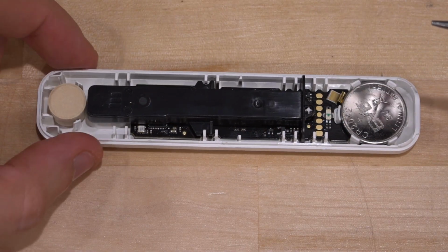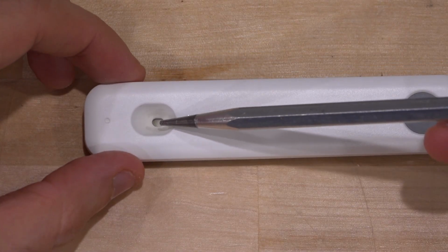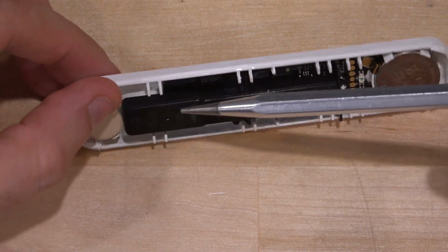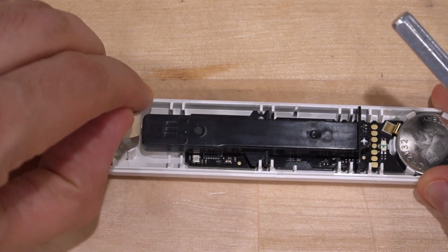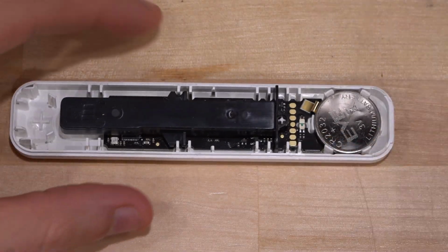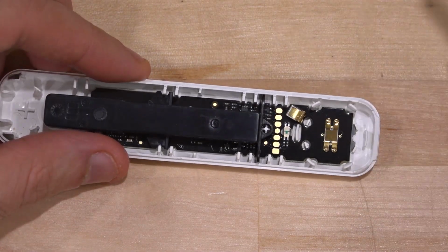And let's see what we have here now. All right, pretty cool. So on this side is where you drop in the sample and of course the activation and as well as your own sample mixed in with it. I wonder what this is. I wonder if this could be for attracting moisture. It certainly feels like it, in order to make sure it stays completely dry. I'll put this aside. We can take the battery out as well. There we go. Very cool.